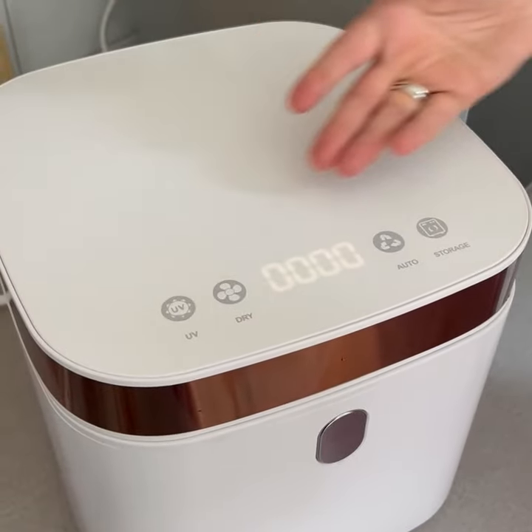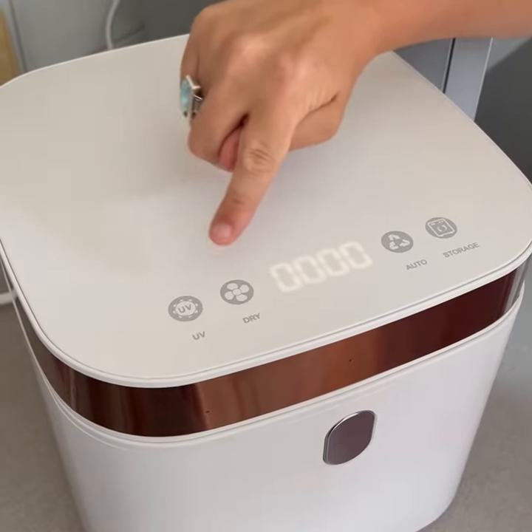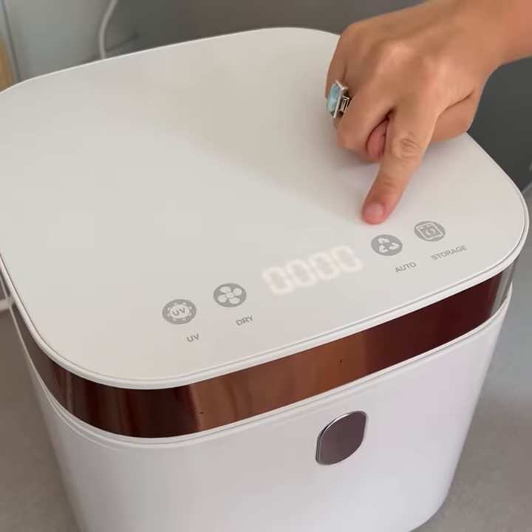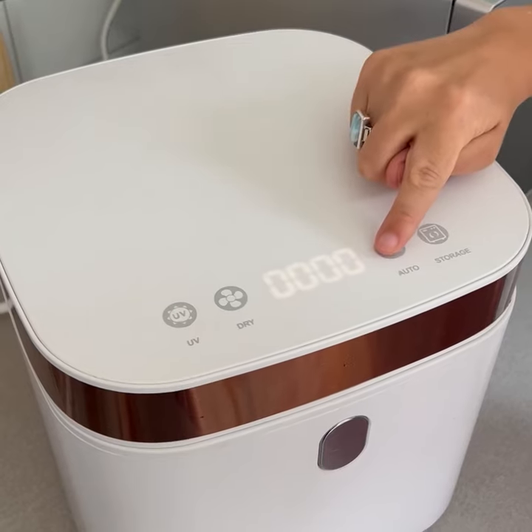Our sterilisers have four functions to choose from. A sterilise function for items that only need to be sterilised. A dry function for items that require drying. An auto function for items that need to be both dried and sterilised. And a storage function to keep your important items bacteria free.